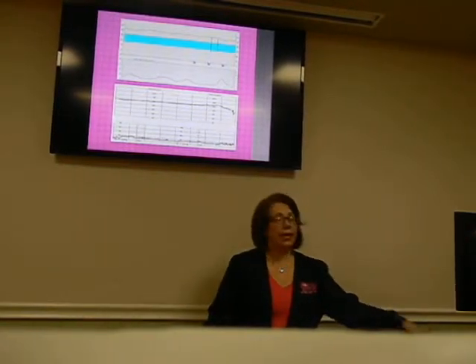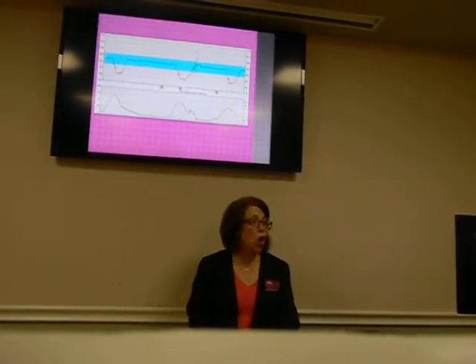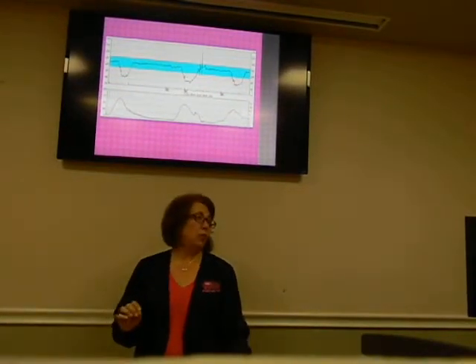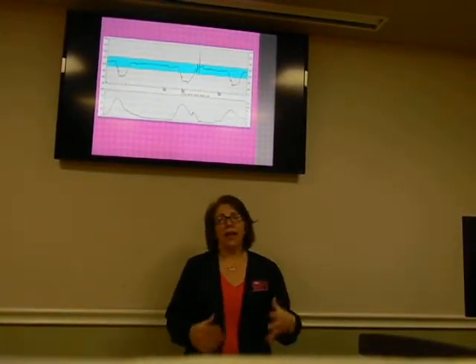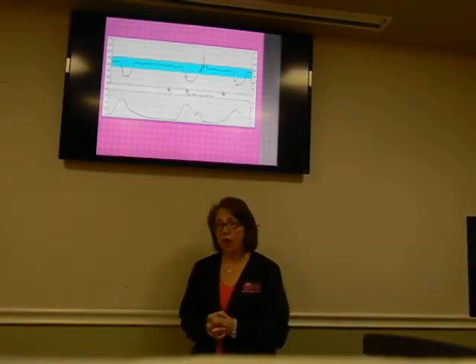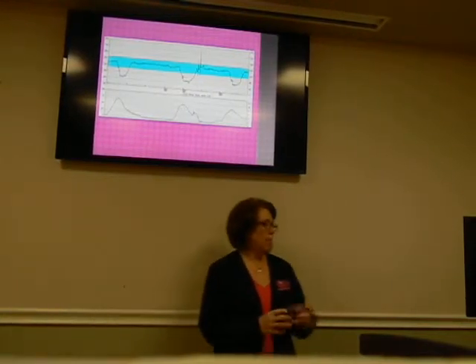Now, if you see squiggles that dip below the baseline fetal heart rate, then that is an area of concern. It shows that the baby may not be getting enough oxygen, and we might have to do something about that.